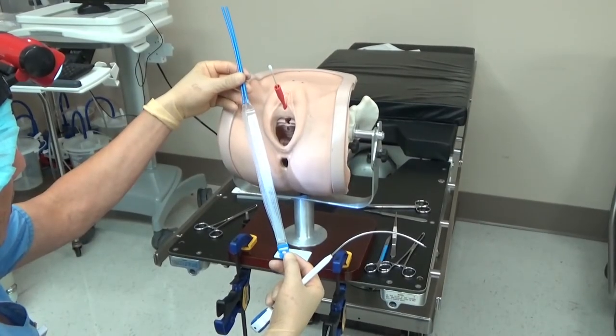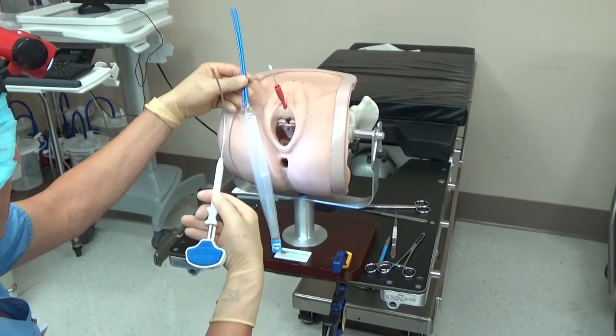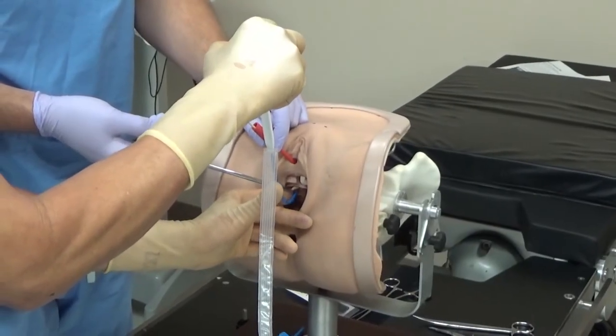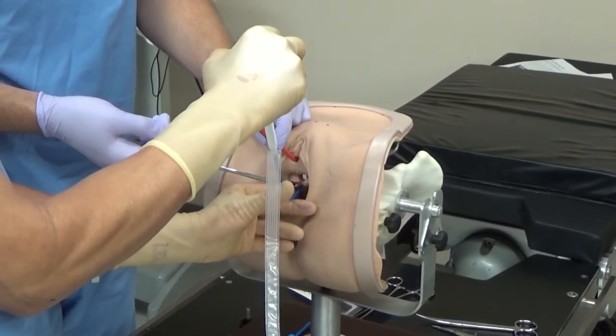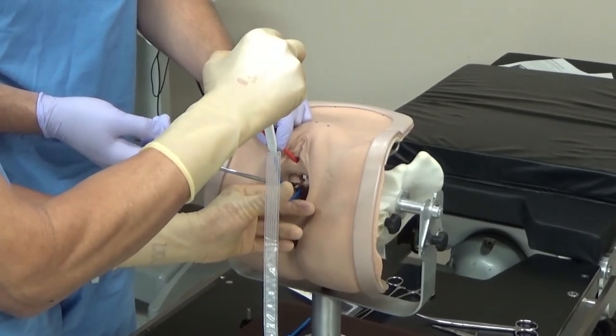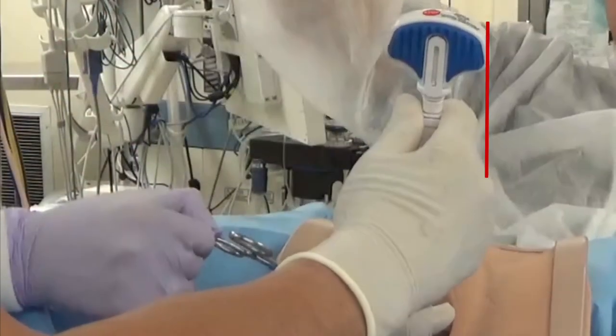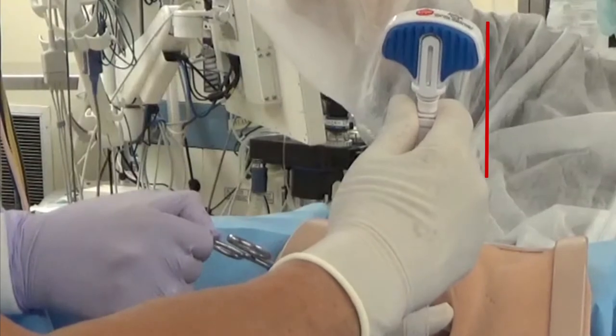An Advantage sling is used for demonstration. The tip of the trocar is inserted into the dissection pocket lateral to the midurethra. Awareness of the handle position is key to prevent unwanted migration of the trocar tip. Note, the rigid Q-tip catheter guide is deviated to the ipsilateral side of the trocar placement. The flat portion of the handle and the trocar tip are directed towards the ipsilateral shoulder of the patient.